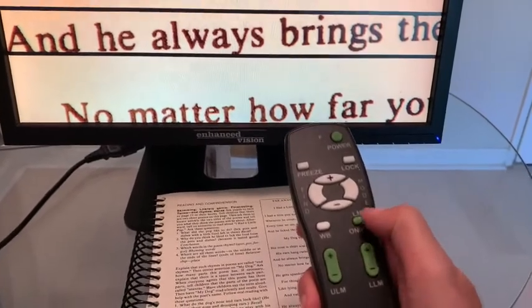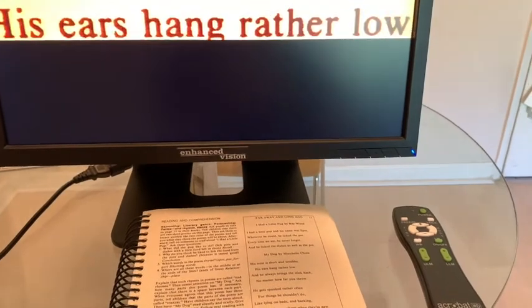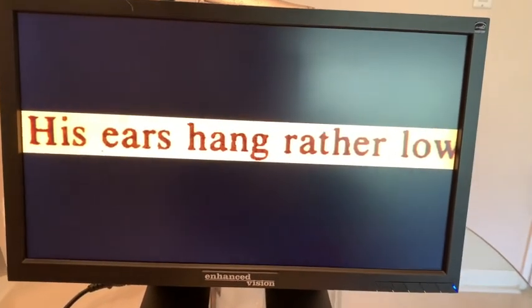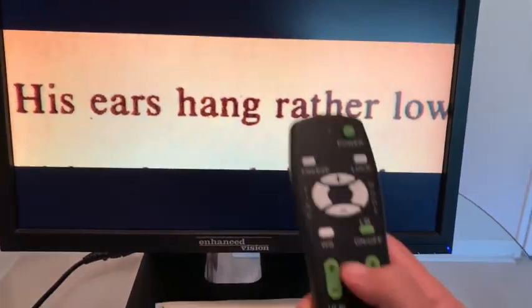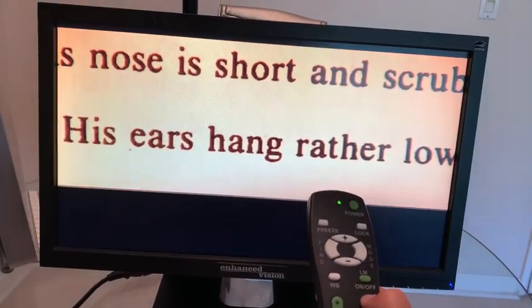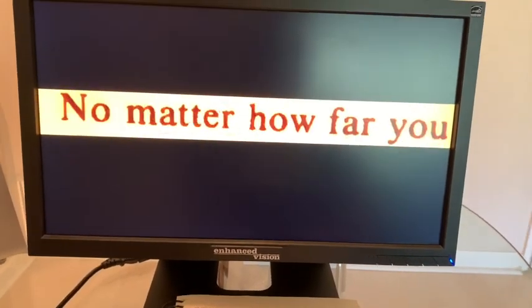Now we'll skip the vertical one and go to the mask. The mask is great — it's the same thing but it takes out all the other information. If you want to play around with the width, use the upper and lower controls. Let's make it more narrow again, starting with the lower then taking the upper down. That's pretty much how it works — moving the material slowly takes some practice with these line markers.